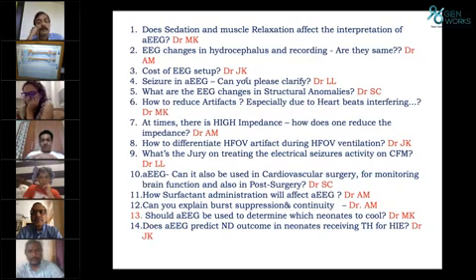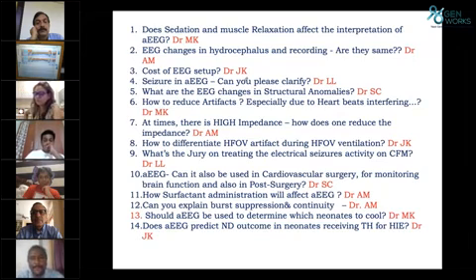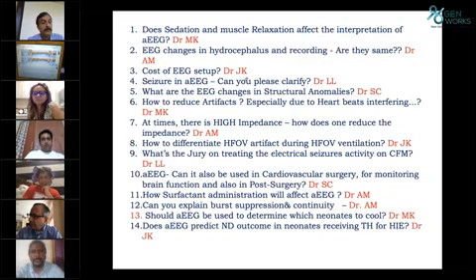And as you rightly said, the recurring costs are there in terms of electrodes, which can be reused if we have properly maintained them. But the usage right now in terms of asphyxia, for example, in a place like Bijapur, we see daily around 5 to 6 admissions with perinatal asphyxia in a term unit I'm talking about. In such a scenario, to explain the prognosis, the predictability of the outcomes and neurological outcomes, I think this machine will definitely be cost effective, provided we do good work.